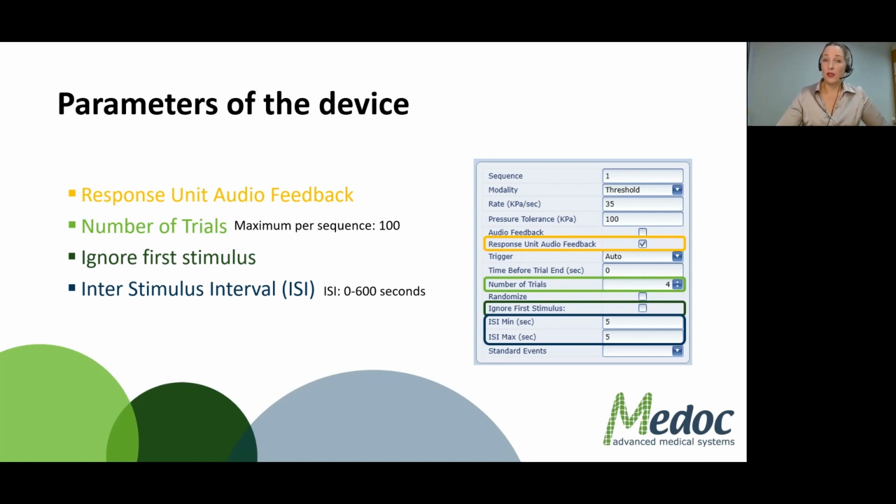In contrast to thermal stimuli, this stimulus doesn't start automatically. It only prompts you to start applying pressure. So you have to see it in this light. At the end, it is up to the operator to apply the pressure at the right time. If you start applying the pressure before the countdown is over, by the way, those results are not noted. So you'll have to wait for the countdown to end. Again, a parameter that you have to keep in mind and that you need to come to a decision about.